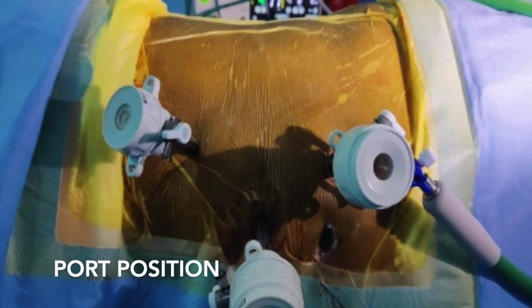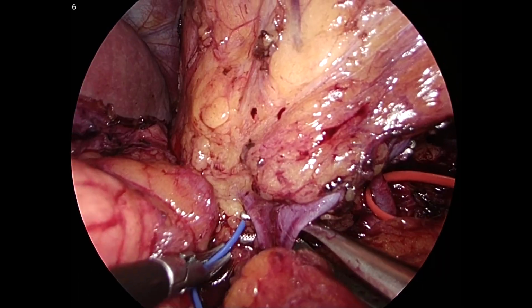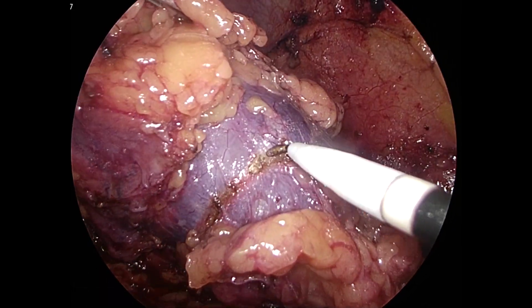Standard three ports, as we use in a left nephrectomy, were placed. After left colon mobilization, hilar dissection was done. A single artery and a single vein were identified and looped. Tumor marking was done, corroborating the CT findings.